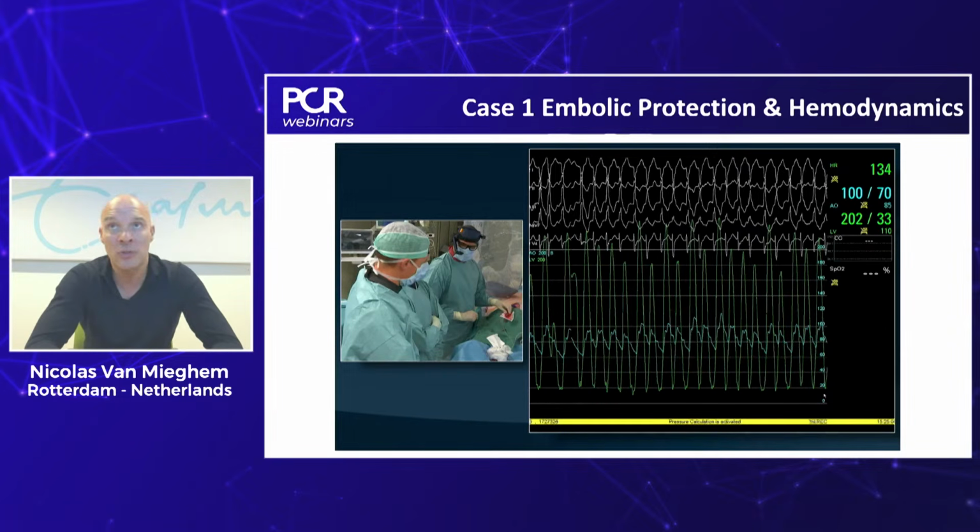It also is important to help determine the AR index. The AR index will help us understand the severity of paravalvular leaks if they would be present after the valve implant. And you want to have your reference. This is the time when you make your reference. An AR index upfront before the valve goes in is required to help understand the AR index after the valve implant.